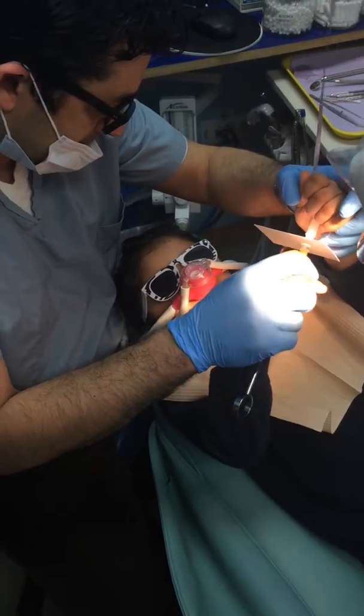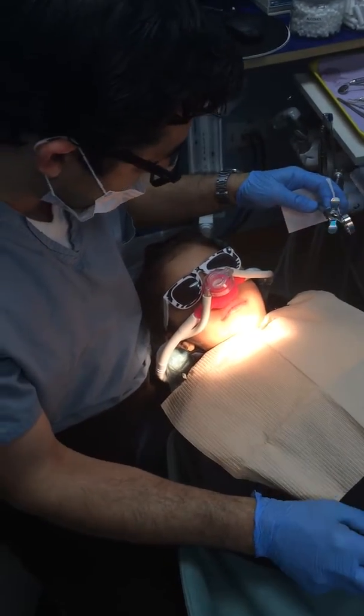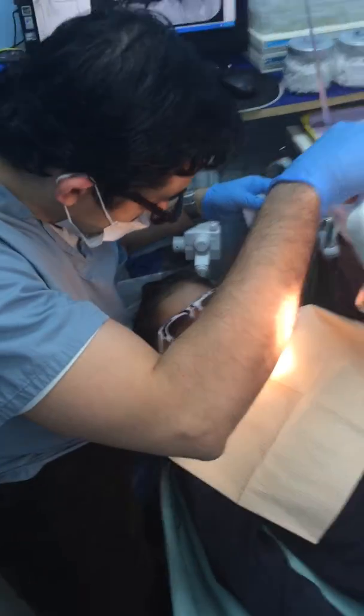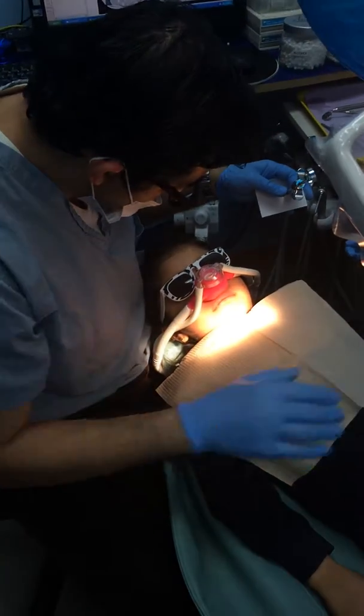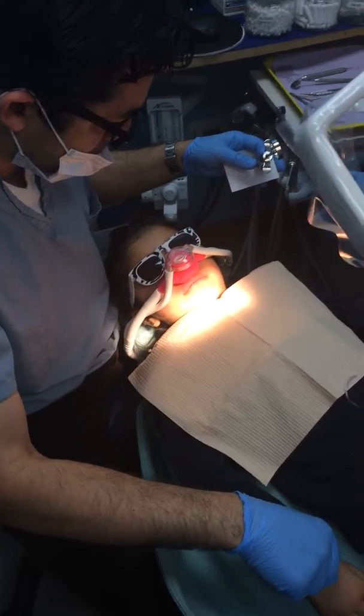We're going to massage it just like that. If you feel any pinchy-pinchy, I want you to raise your balloon, okay? Can we test that? I'm pinching-pinching — what are you going to do? Raise your balloon? Can you show me if you can raise your balloon?